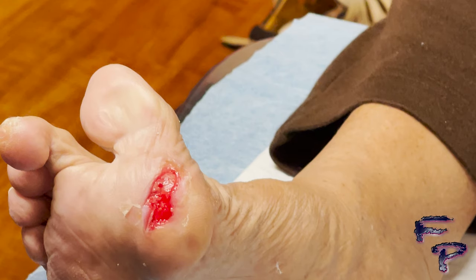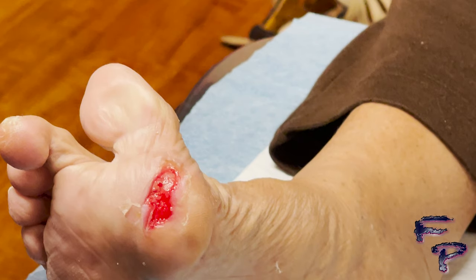Now let's briefly go over how to dress this wound. You can see this wound is red and granular with no signs of infection. I like to utilize a collagen type dressing, which will be changed three times a week.